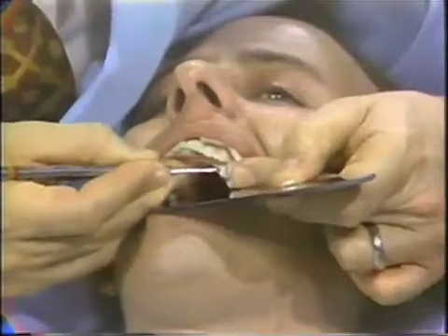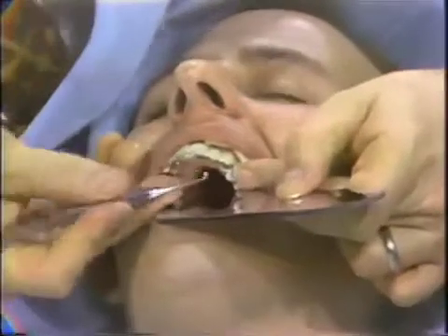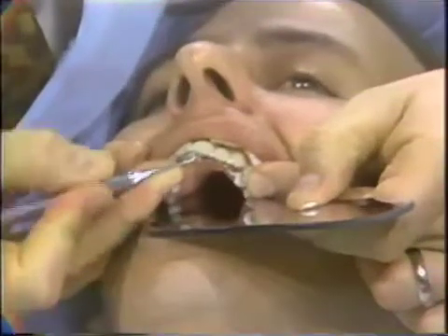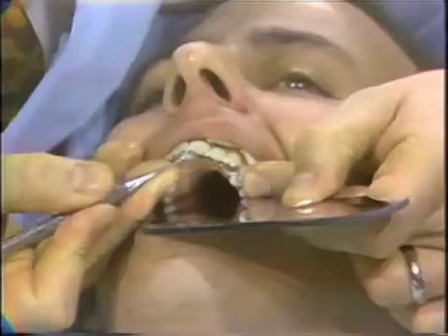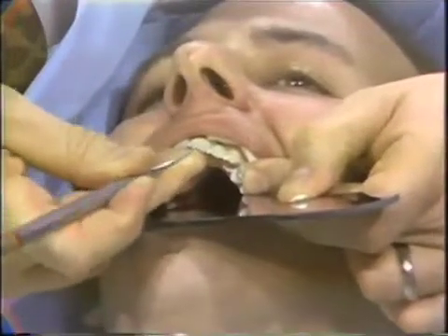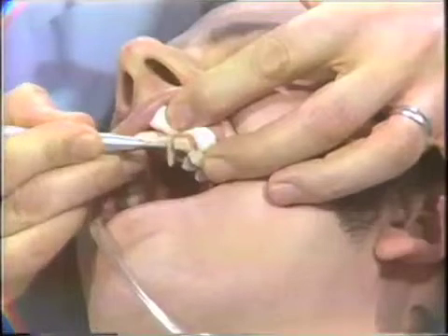All margins that are accessible are then burnished with a 5S burnisher. The hydraulic action of the cement oozing out of the margins tends to open them slightly, and at this point the fine margins are burnished down. The incisal margins can also be burnished at this time. A sand disk is then used to round and finally finish the incisal margins.